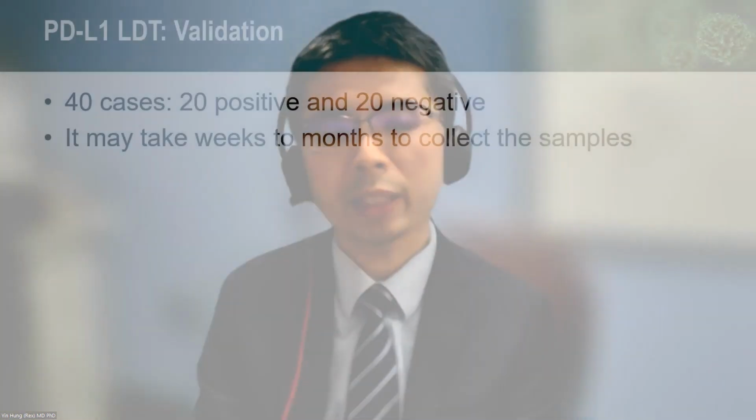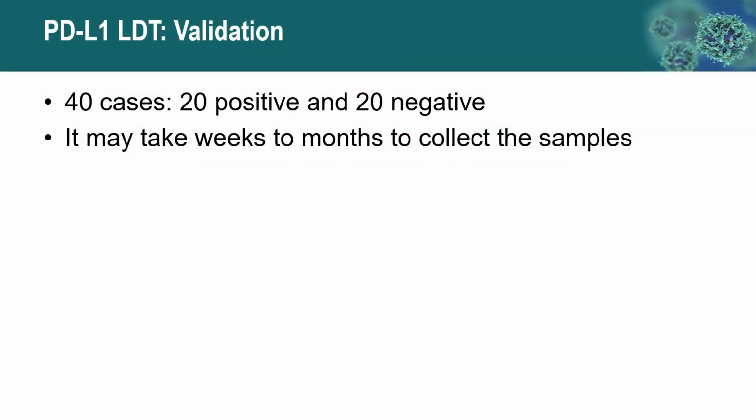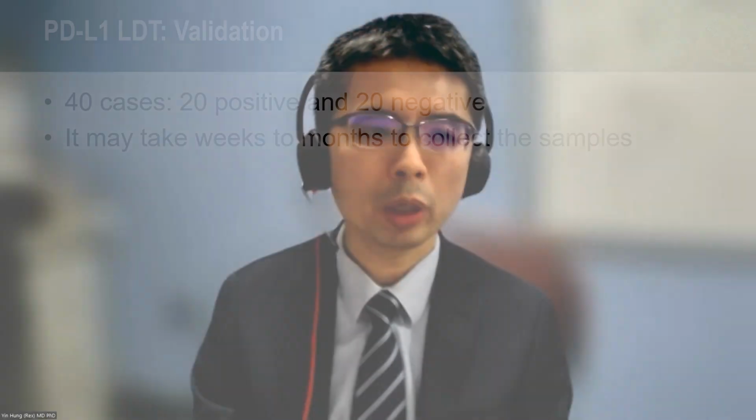I think in practice, in order to really make it happen, it's not something that one can do overnight. It takes weeks, if not months, to collect those samples, depending on the clinical volume. And I think that creates one challenge.